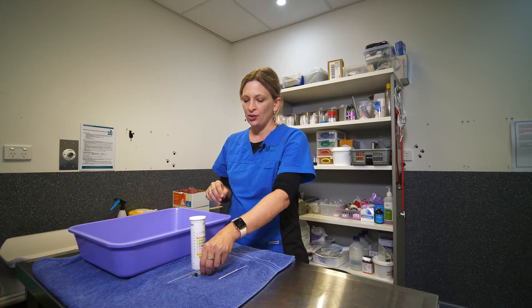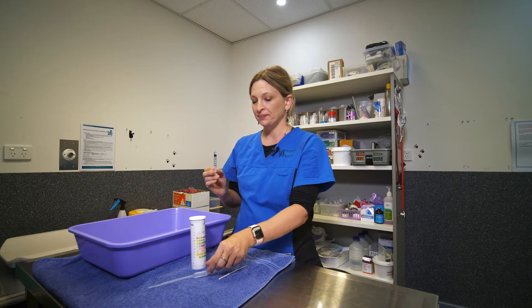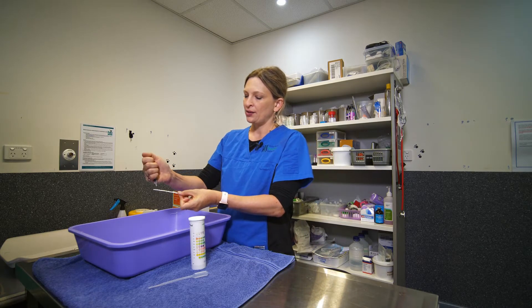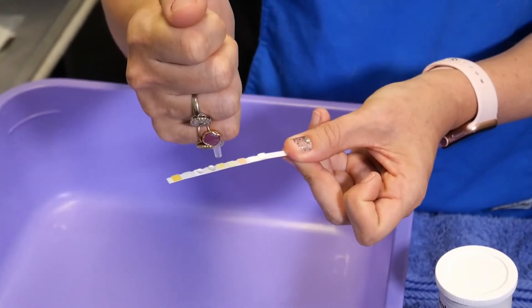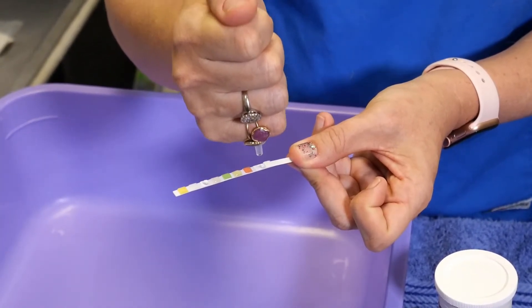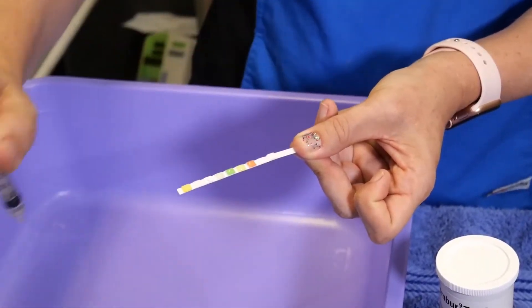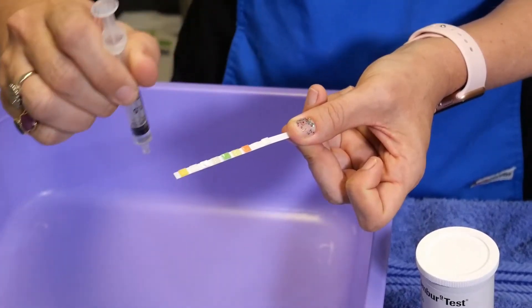Generally what you'll do is once you've obtained the urine sample, either in a syringe or in your pipette, you then take your dipstick out of the container and individually put a drop of urine onto each of the little squares like so. Ideally you don't just run the urine across the strip because then you might get some bleeding across the different boxes.